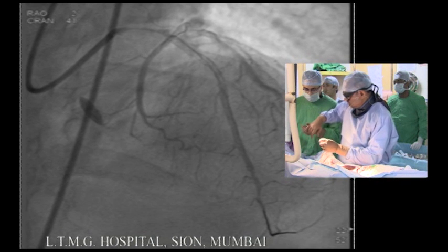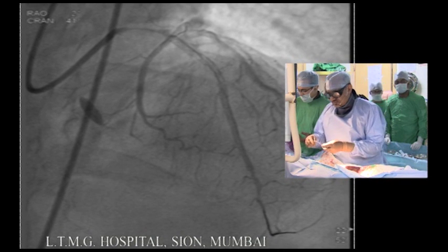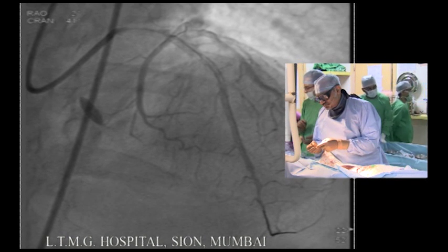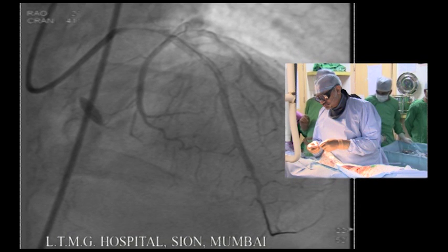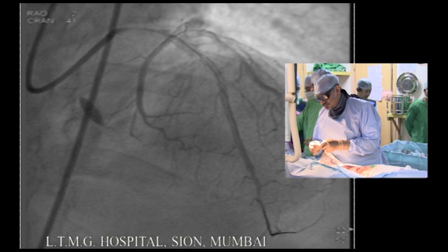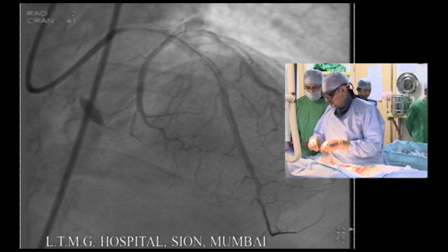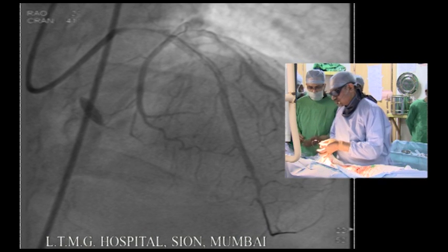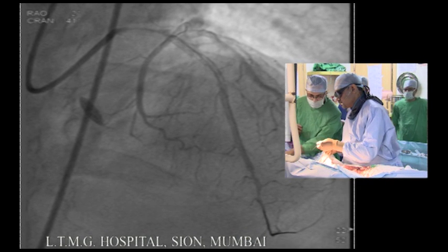I will probably do the IVUS after pre-dilatation still because it will be much easier to cross it, and this is what I will probably do in this case. If it's possible, of course, an IVUS before everything, what you start to do is the best option, depending on the narrowing, how big is it, and how critical is the lesion.